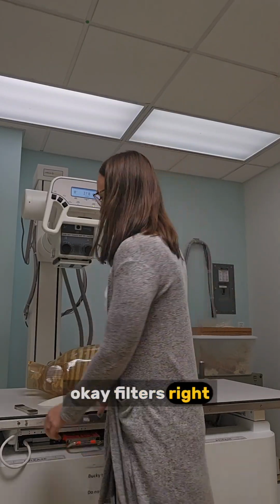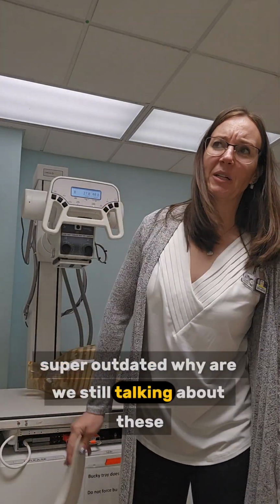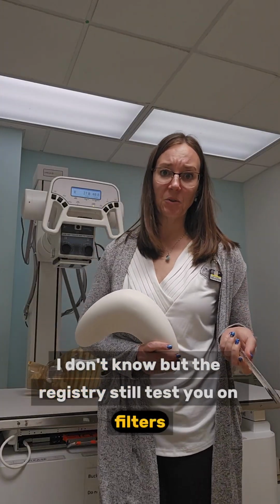Okay, filters, right? Super outdated. Why are we still talking about these? I don't know. But the registry still tests you on filters, so we're going to talk about it.